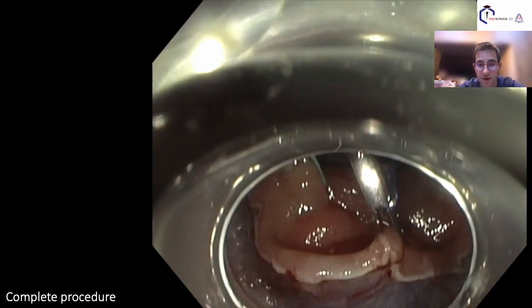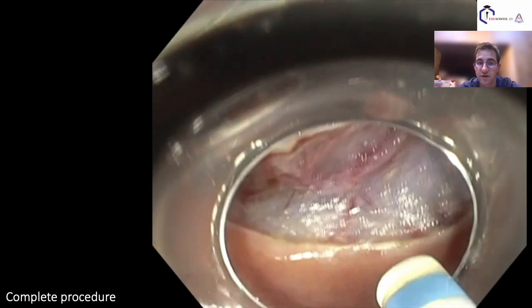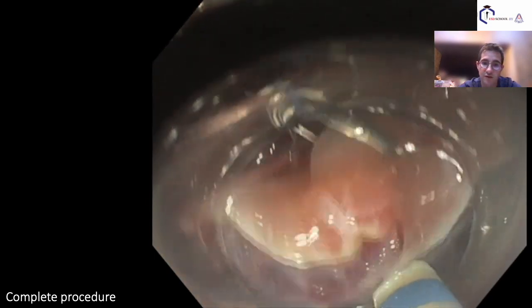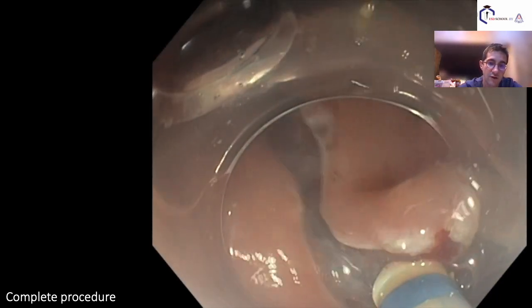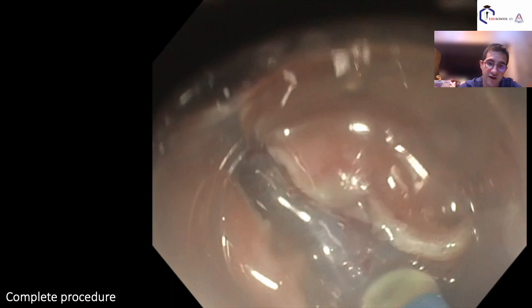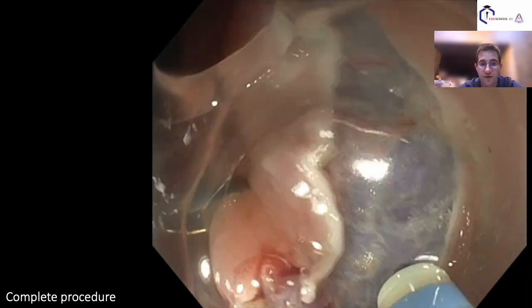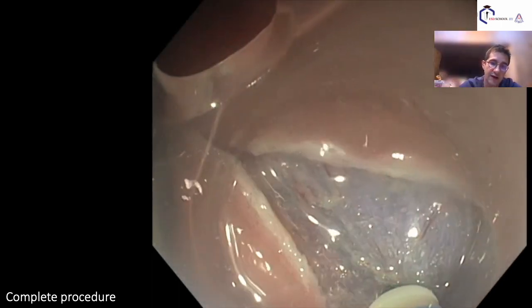It seems very easy now, thanks to the traction, but in fact the scope control was again not very good, and I could not adjust the length of the device because as soon as I removed my hand, the scope was not stable. So in fact I should stay catching the scope itself and fixing the length of my device, which is probably not the most effective. If you can find a position where the scope is totally stable, it's sometimes easier to adjust the length of the knife with a continuous movement, and after you try to follow the cut line.